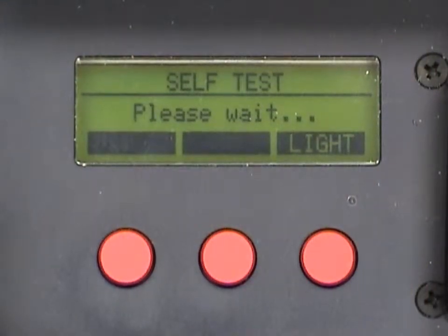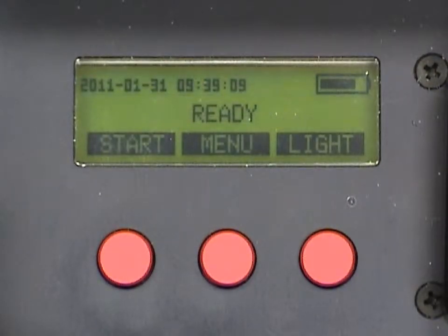The reader will perform a self-diagnostic test to ensure proper reader performance. The display shows the current date and time, plus the start, menu, and light options corresponding to the buttons below.